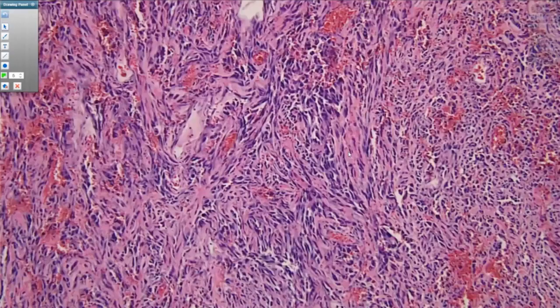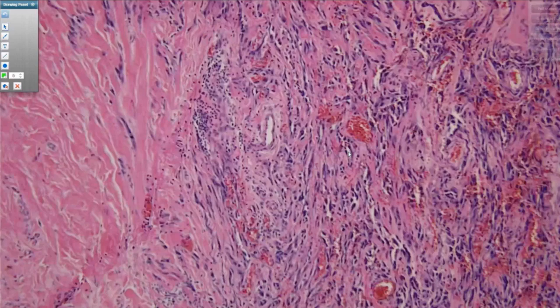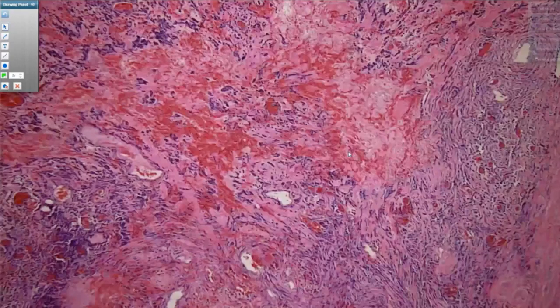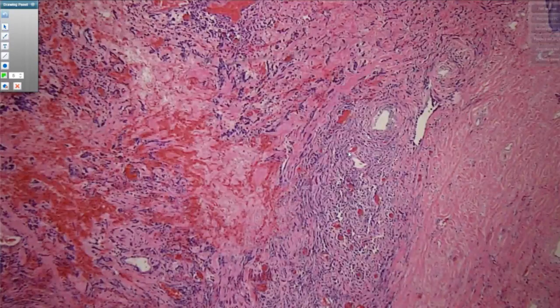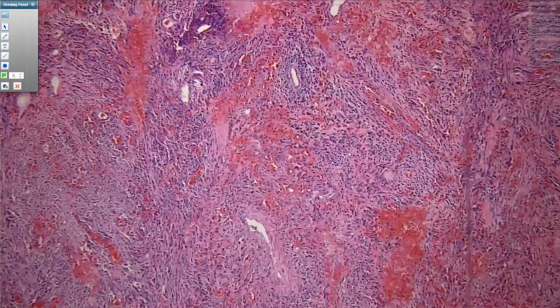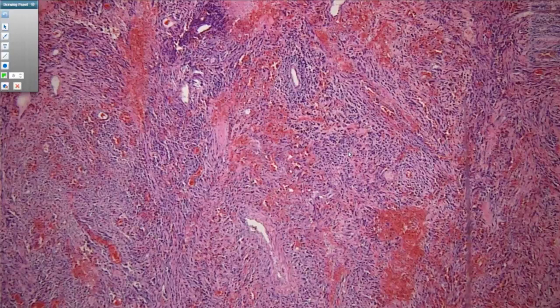Now, the post-radiation angiosarcomas occur in the superficial aspects of the breast, in the dermis, and then they'll extend deeper. The primary breast angiosarcomas that are not post-radiation associated tend to occur in the deep breast parenchyma and in younger women. So those are sporadic primary breast sarcomas. They will label the same as other vascular neoplasms.